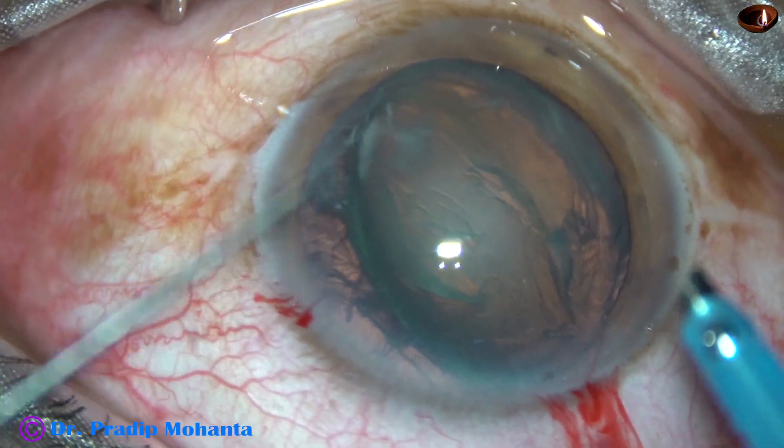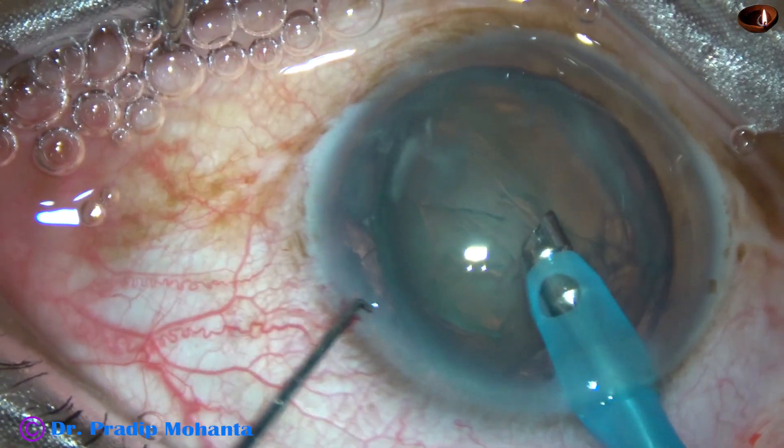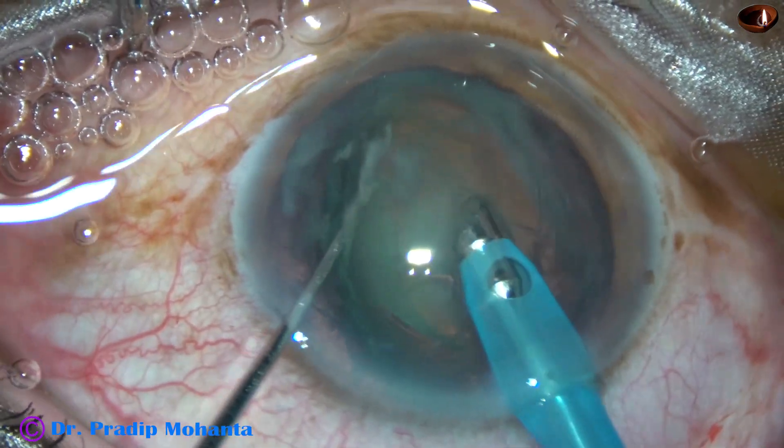The needle faces the nuclear mass. The chopper supports the posterior surface of the cataractous lens.